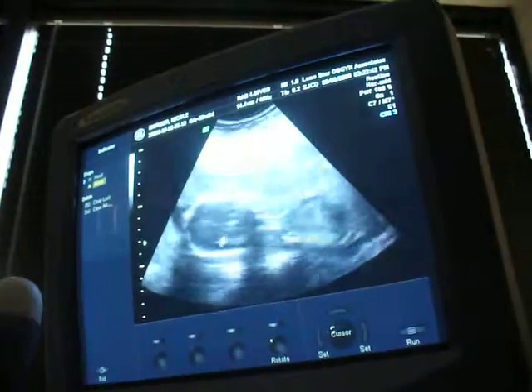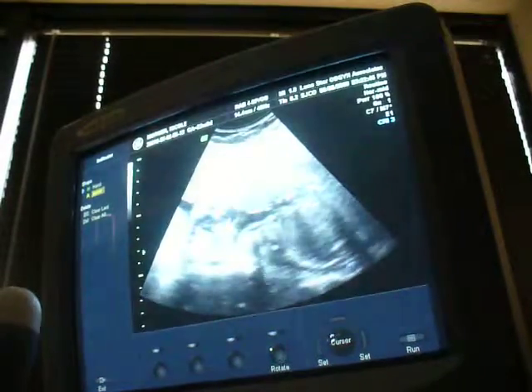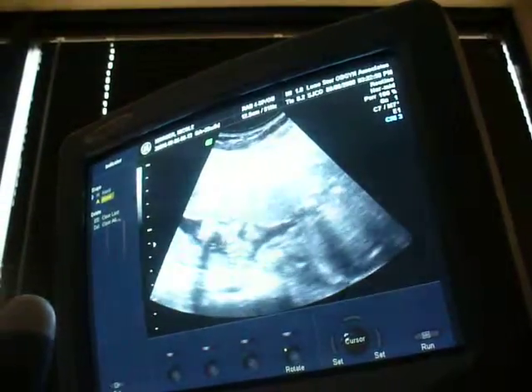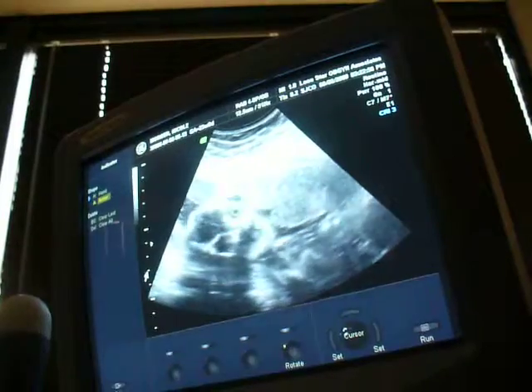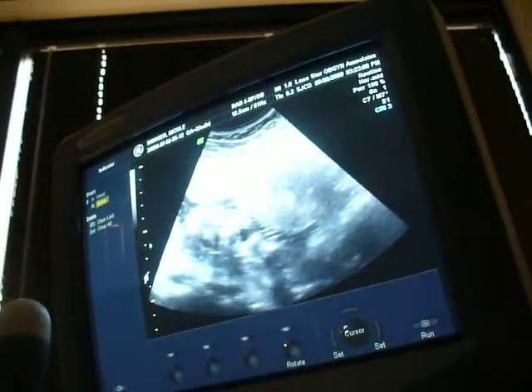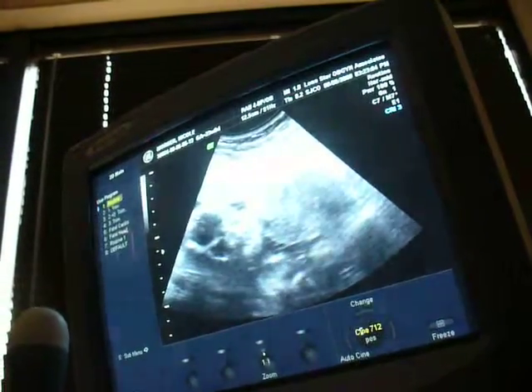Now I'm going to come over here to the head again so we can look at the face. Got the little mouth open right there. See how I just moved it? These are the little holes of the nostrils. There's the mouth, a little hand. And then there's the little eyes right there. See it? So there's the little front of the face. It's just yawning, yawning. It doesn't like me bothering it. That's adorable.